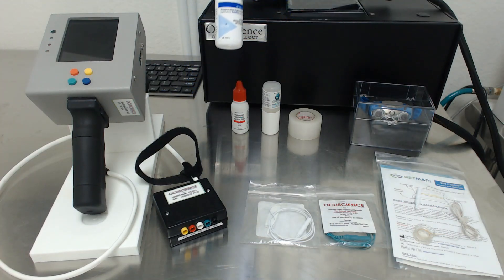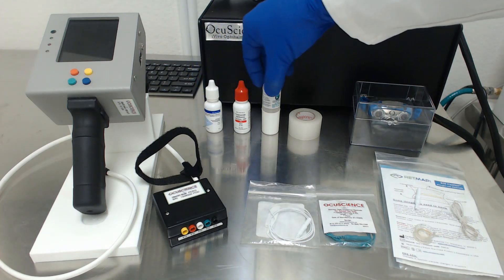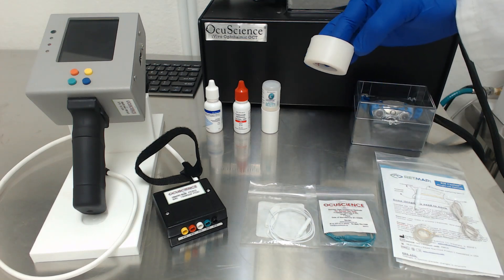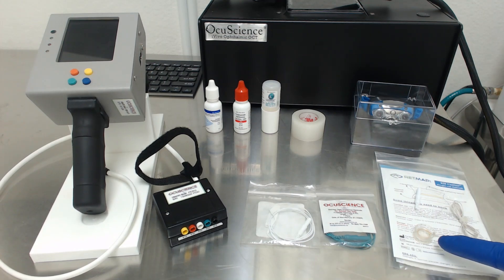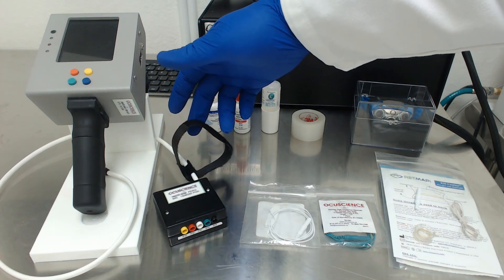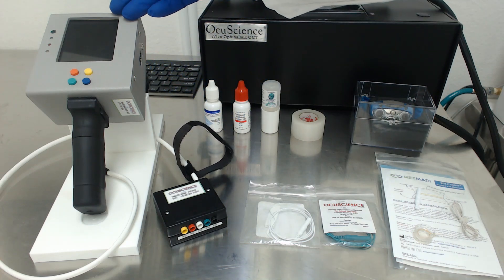Today I will be using Proparacaine, Tropicamide, Goniovisc, a red LED headlamp, and tape to keep the electrodes in place once they are on the dog. We are only doing a single channel ERG, so I will only use two subdermal needle electrodes and one RetMap K9 single-use contact lens electrode. We will also use a velcro strap or badge clip to keep the pod connected to the dog's collar, as this makes running the ERG a lot easier. And we will of course be using our HMS ERG unit.